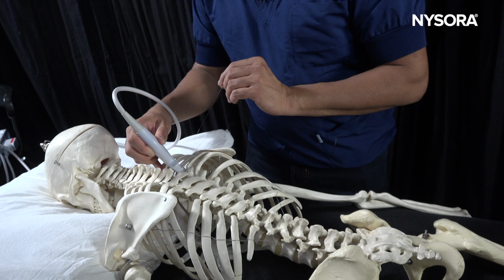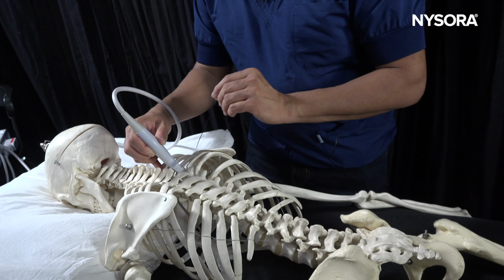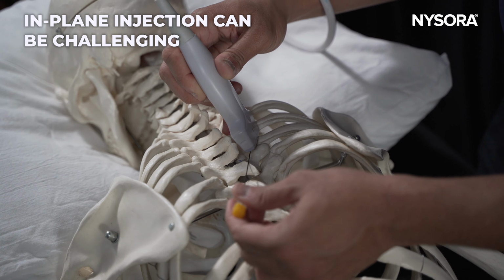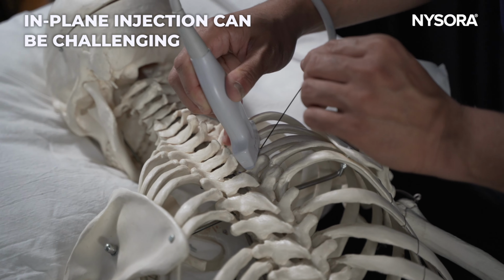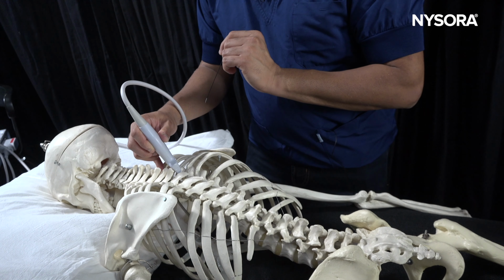Volume would be maximum 1 ml of local anesthetic and steroid mixture using a 25 gauge hypodermic needle. You can also perform the injection in plane, but given the angulation, it can be trickier getting into the joint using an in-plane technique. So my technique of preference would be the out-of-plane technique, going into the joint and injecting local anesthetic and steroid. Thank you.